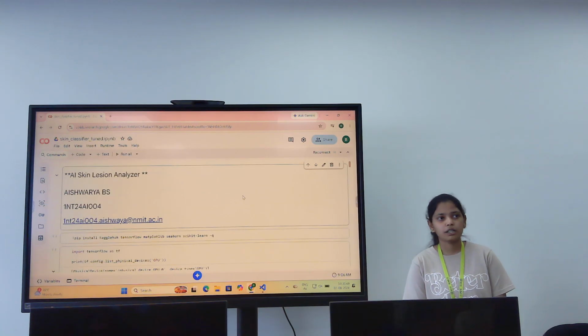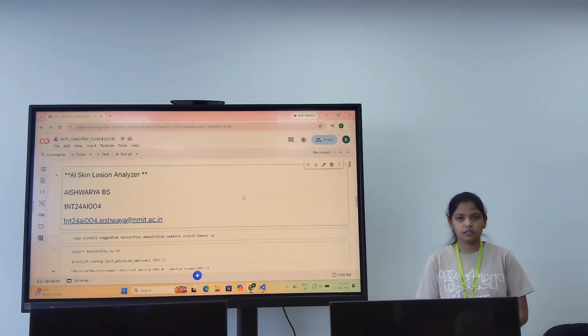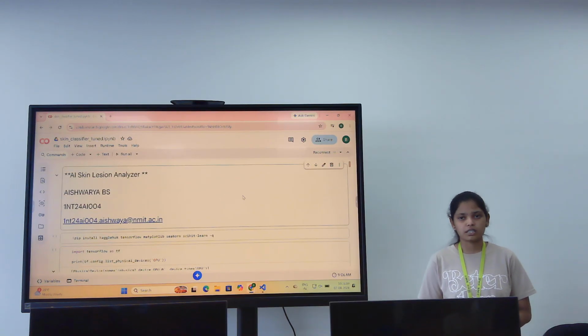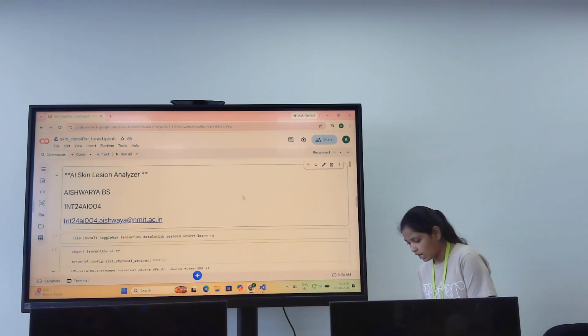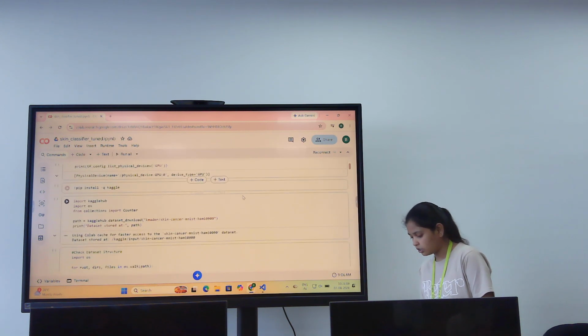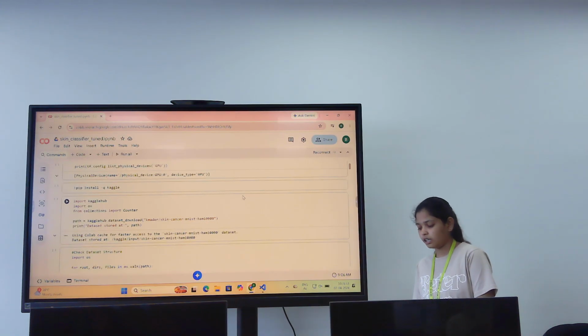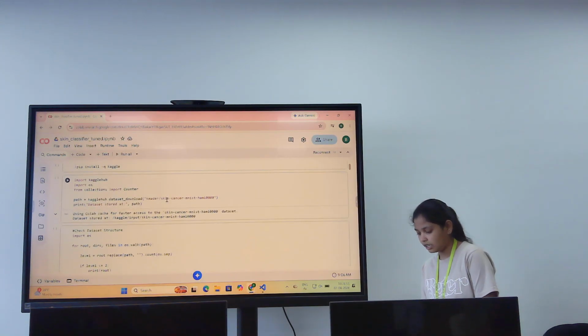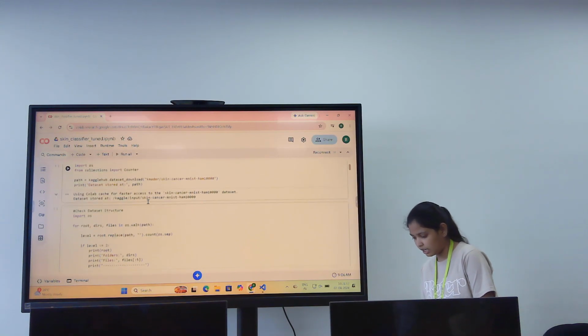My objective is to build a system that takes a lesion image as input and makes predictions, and makes the result easier for users to understand. To train the model, I use the HAM 10,000 Kaggle dataset. Here I import the dataset using Kaggle.